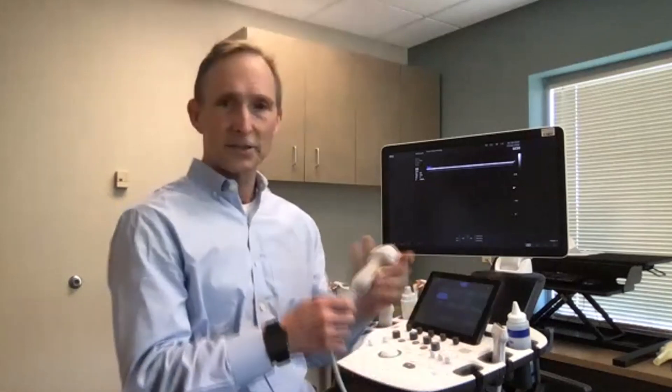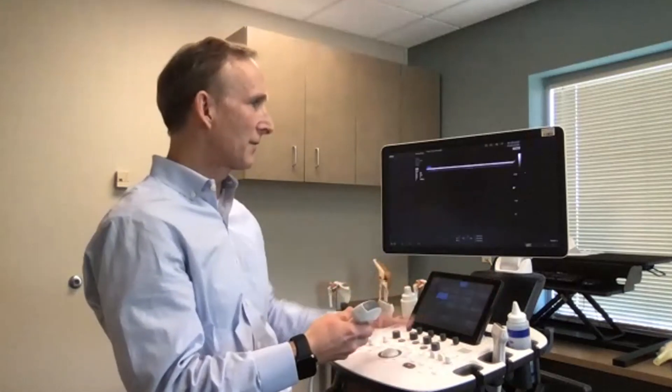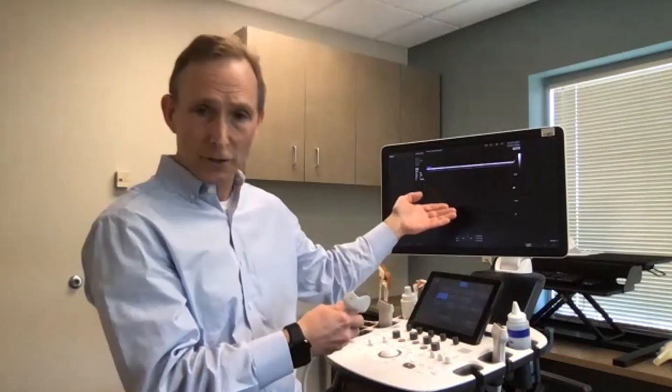Musculoskeletal ultrasound uses the same technology that you may find in an obstetric office or an ultrasound used to image other parts of the human body, where a device called the transducer emits ultrasonic waves which penetrate the tissues in the human body, returning to the transducer at different rates, which are then interpreted by the computer and provide us an image on the screen.